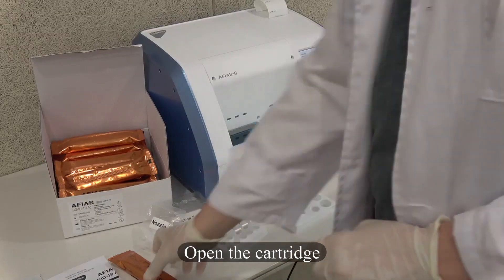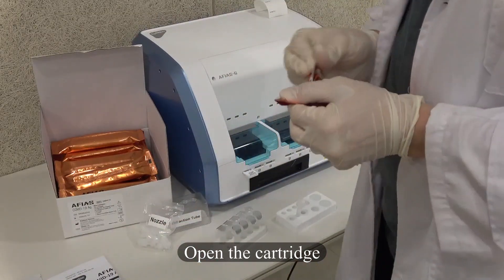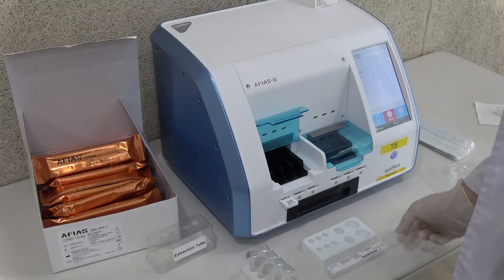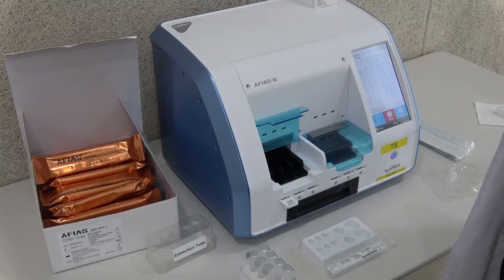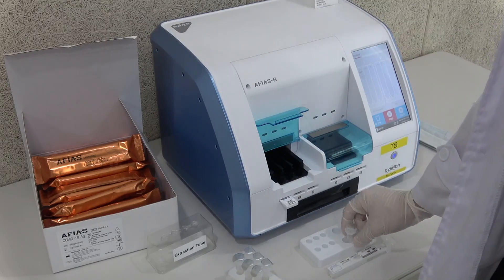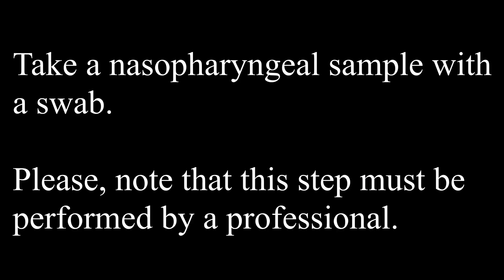Test Procedure. Open the cartridge. Take a nasopharyngeal sample with a swab. Please note that this step must be performed by a professional.